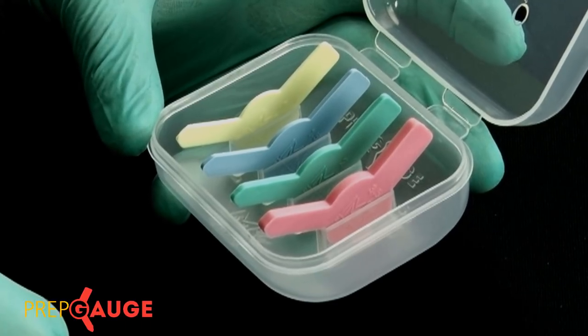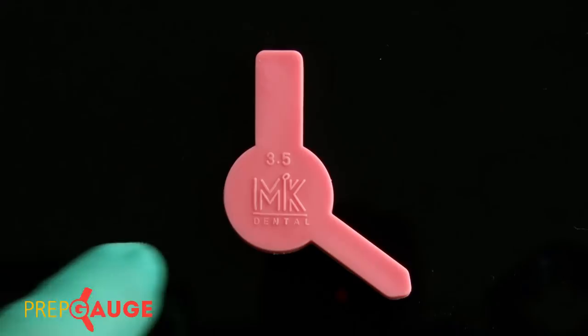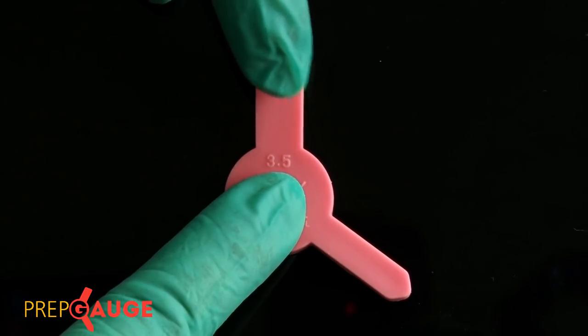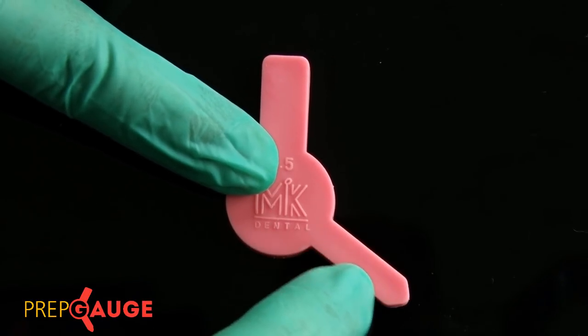Let us now understand the design of the shape of these gauges. The first thing to acknowledge is the angular nature of the gauge — this shape allows for the gauge to be used even when checking clearance on the distal-most tooth in the oral cavity, which would otherwise be difficult in the presence of the patient's cheek. Next, note the width of the table: the wider area is about 10 millimeters wide, and this portion is used when checking clearance on wider teeth — essentially molars and maxillary central incisors and canines.